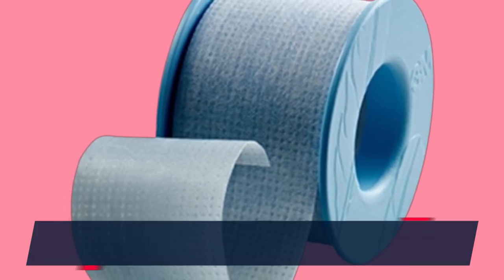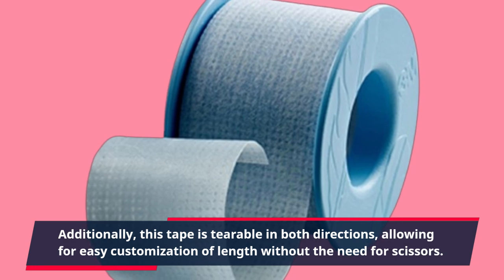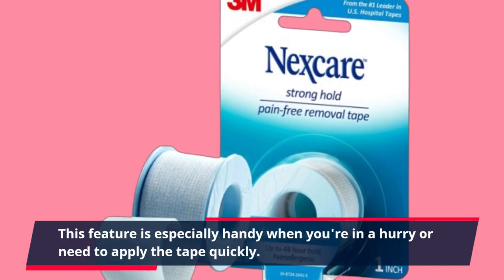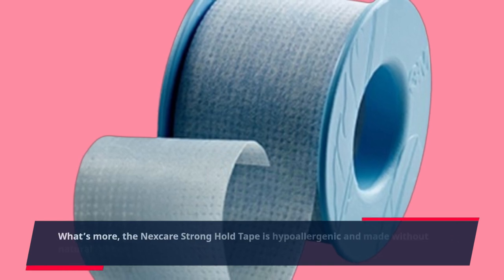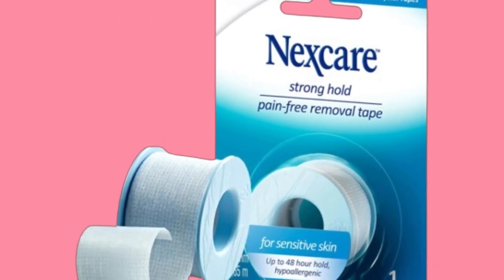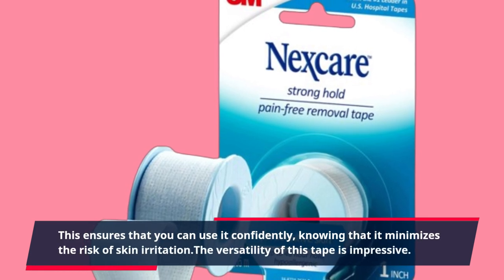Additionally, this tape is tearable in both directions, allowing for easy customization of length without the need for scissors. This feature is especially handy when you're in a hurry or need to apply the tape quickly. What's more, the Nexcare Stronghold Tape is hypoallergenic and made without natural rubber latex, making it a safe choice for individuals prone to allergies, ensuring you can use it confidently knowing it minimizes the risk of skin irritation.